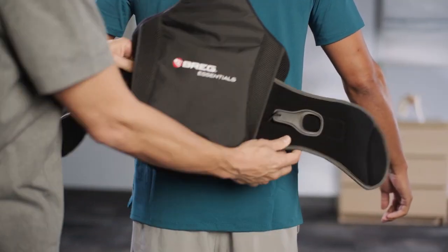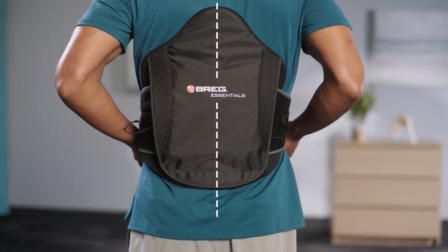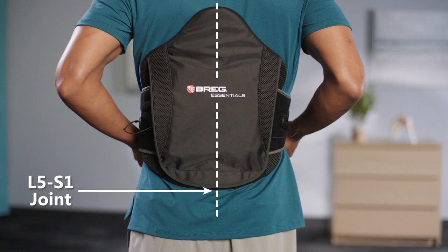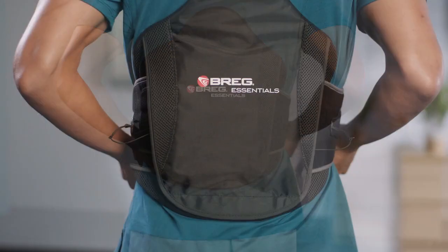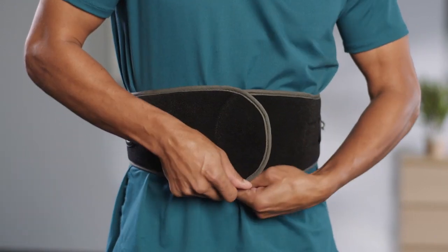Position the brace on the patient. Ensure that it's centered and low on the back. Align the center of the back pad to the patient's spine and align the bottom edge of the back panel over the lumbosacral joint. Fasten the brace around the patient's waist by pulling the right end of the belt over the left end of the belt.